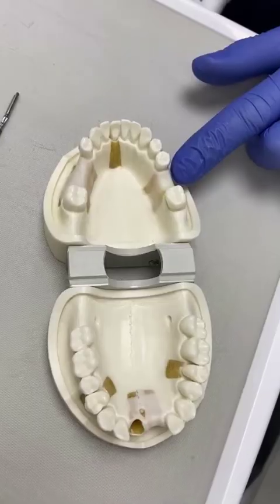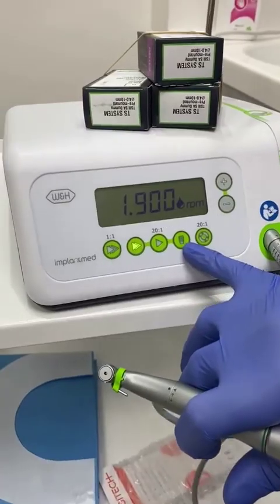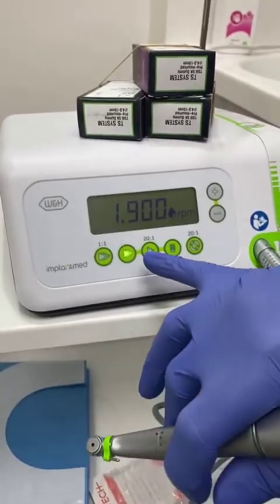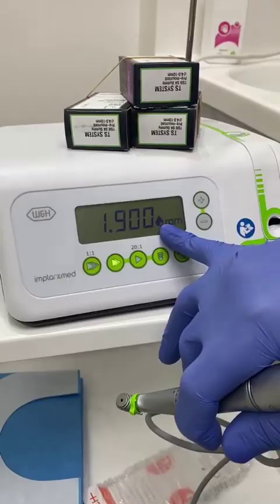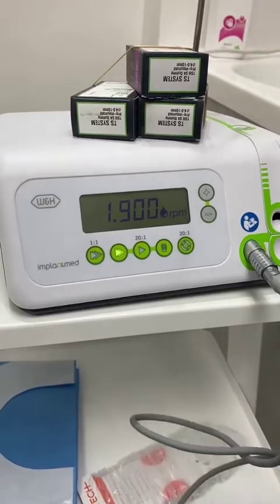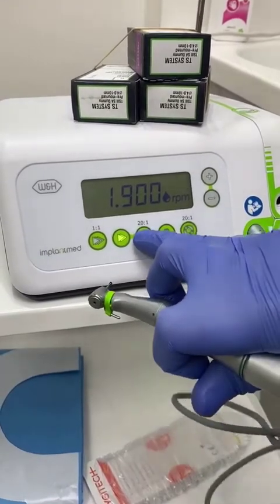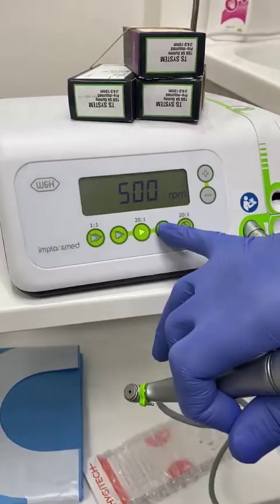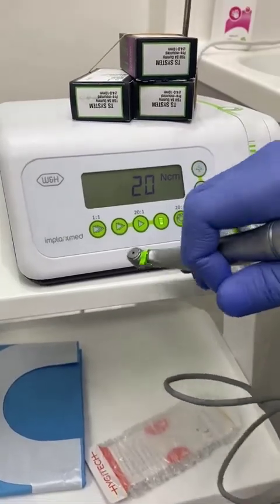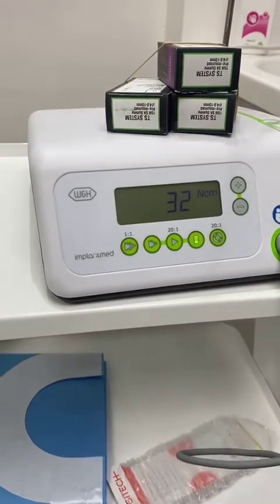Different machines have different settings, but for the 20 to 1 reducing handpiece I'm using, the initial speed is 1900 rpm — it could be 1800 or 2000. As we progress with our osteotomy we want to slow down, partly to harvest bone and partly for more control, and we can change that setting to around 500 or lower. When we come to place the implant, we change to a torque setting where it rotates at a very slow speed and you can adjust the torque value at which it stops.